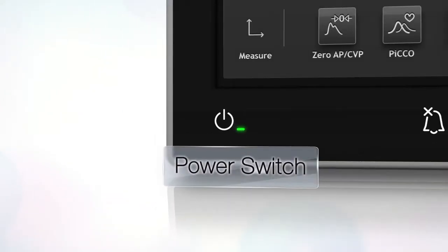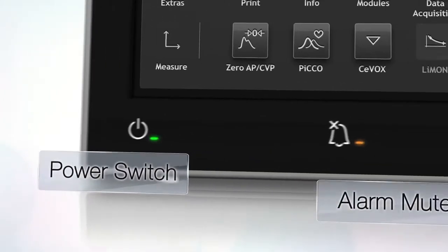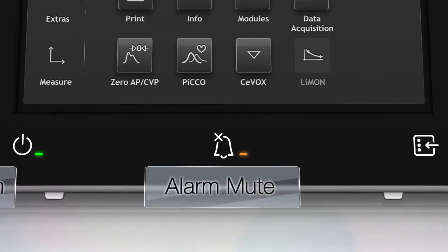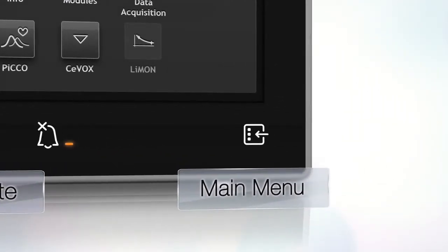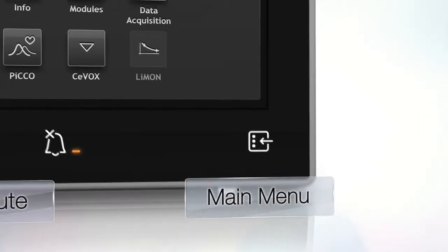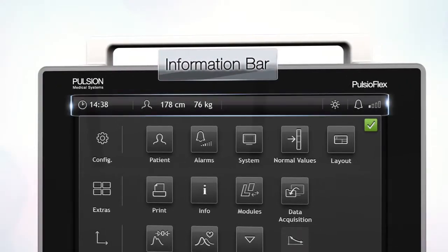Use the power switch to turn on the device. Tap the alarm mute button to silence the alarm. The main menu gives access to all configurations and functions. Press the main menu button to go back to the menu. The information bar highlights information about the patient, their specific measurement details and messages.